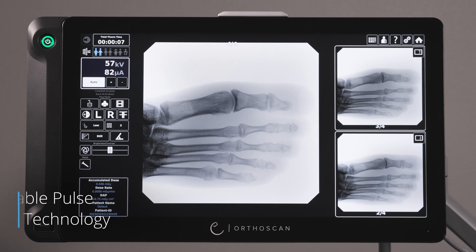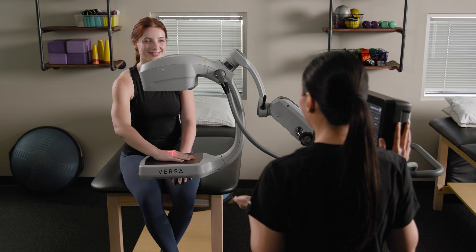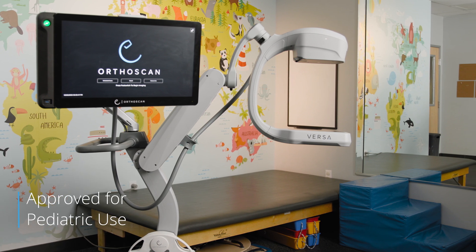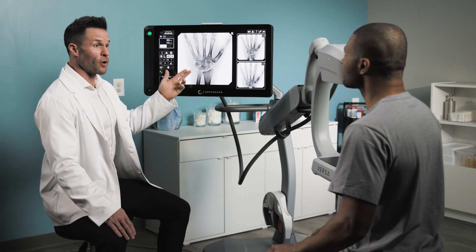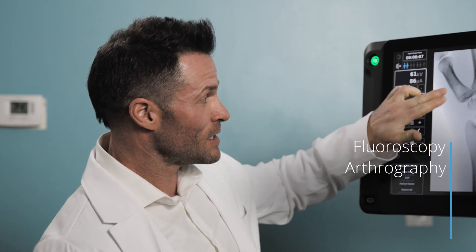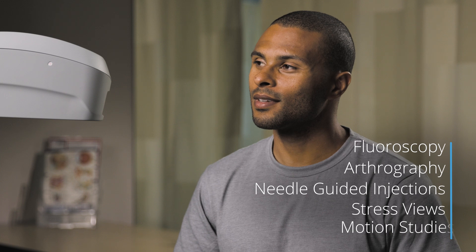Selectable pulse fluoro technology allows for the best image quality available while using the lowest dose required. Versa is also approved for pediatric use. Perform additional procedures directly from your office, including fluoroscopy, arthrography, needle-guided injections, stress views, and motion studies.